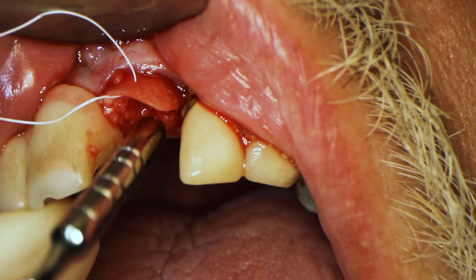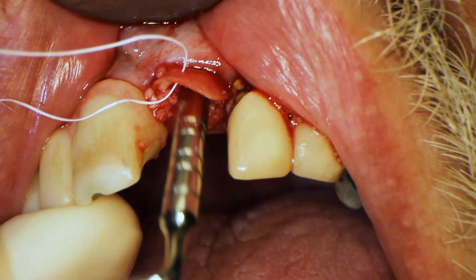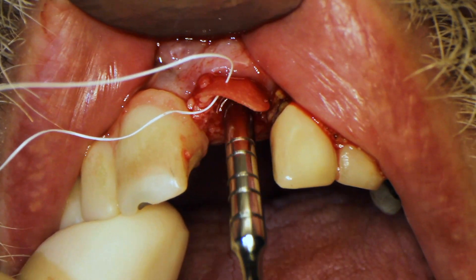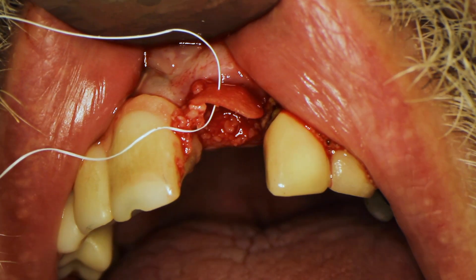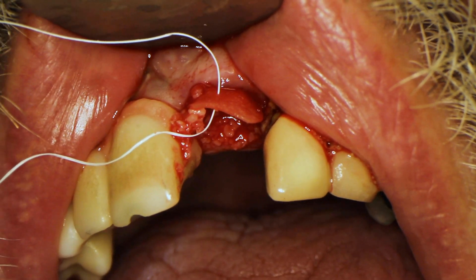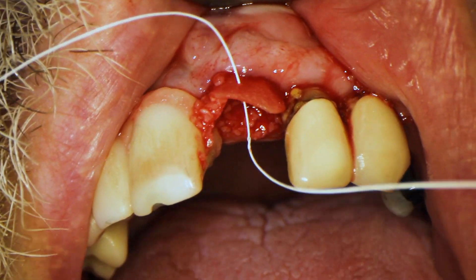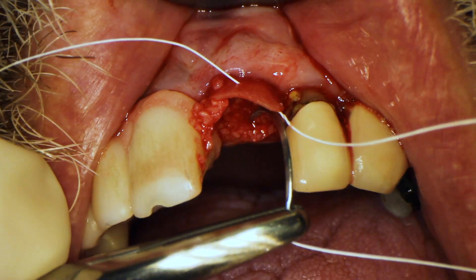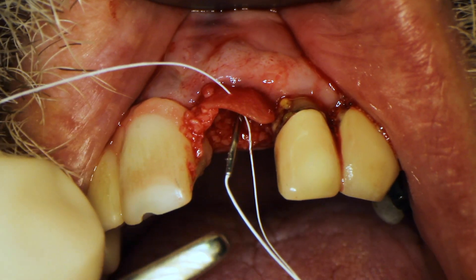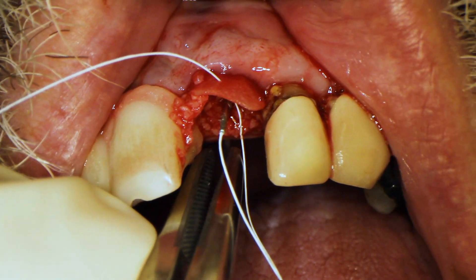I like to pack it really tight, making sure the bone is still wet and has blood on it. I don't want it going in dry and I don't want to cause dry socket. I used to push it down with a 2x2 gauze but had some cases with dry socket symptoms, so now I just make sure the bone is always wet and bloody and push it down with the condenser.